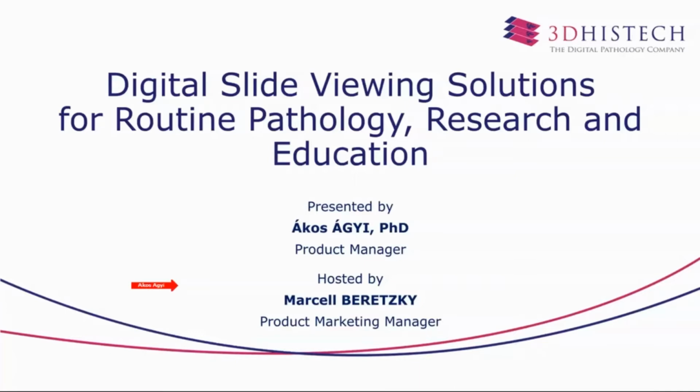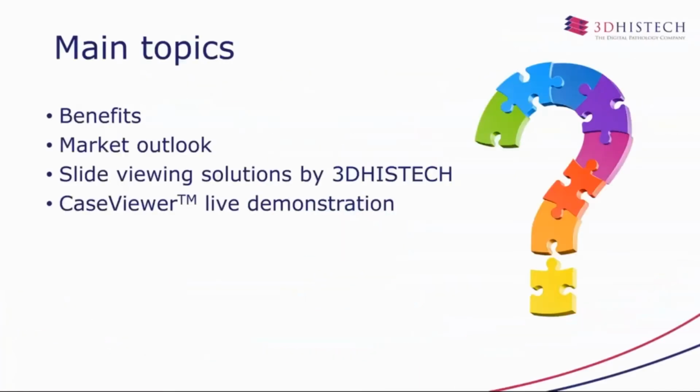Okay, but before I hand over to him, let me give you a brief outline and an introduction of what we are going to see today. I will briefly talk about slide viewing solutions in general, including benefits and a very short market outlook, and then I hand over to Ákos, who will show you in detail our digital slide viewing solutions, and he will take you through an exciting live demo on CaseViewer. If you have any questions, I'm sure you will have some, please hold them until the end, and then we will have an opportunity to answer any questions.